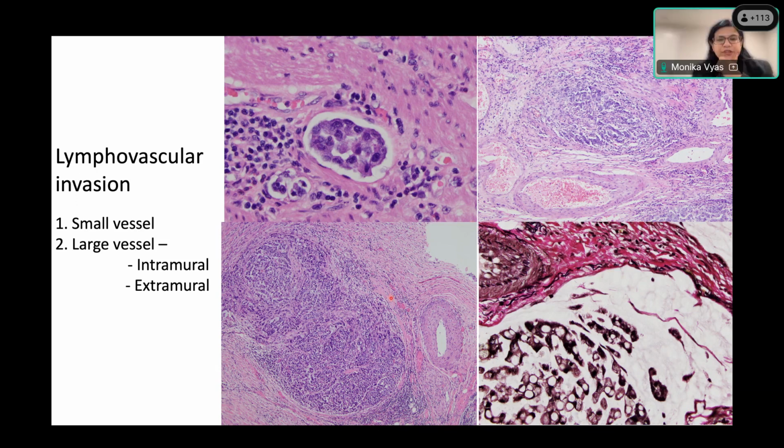Okay, so we talked about small vessel invasion, which is involvement of lymphatics by tumor. And so the next thing is large vessel invasion. What offers you a clue that there might be large vessel invasion is the presence of these naked arteries. So you see a thick-walled vessel, but there is no accompanying vein next to this vessel. So we can't explain that, right? Where did the vein go?